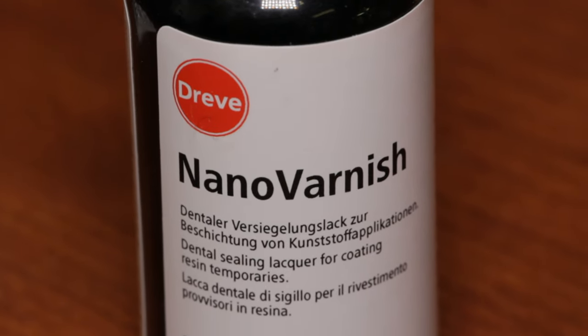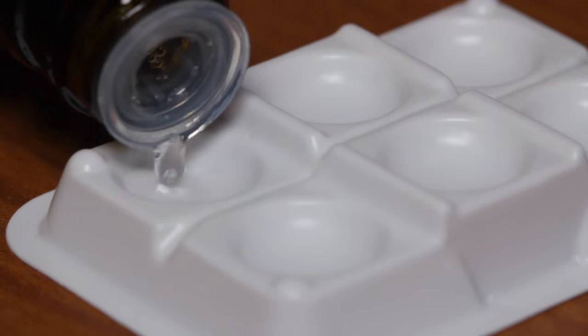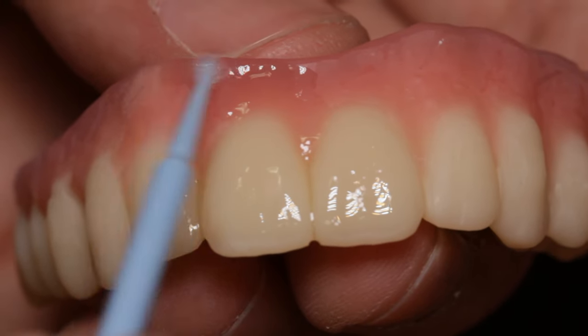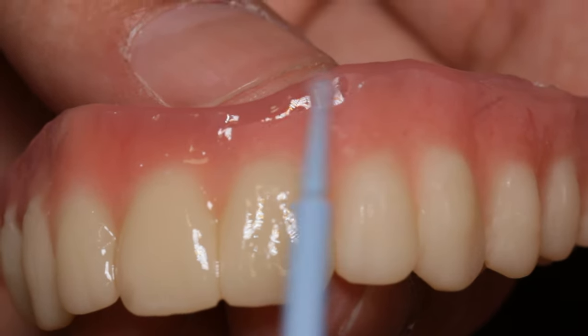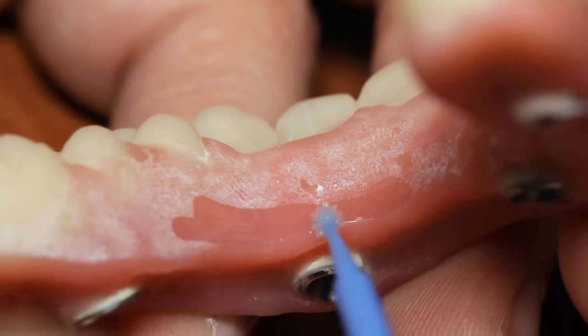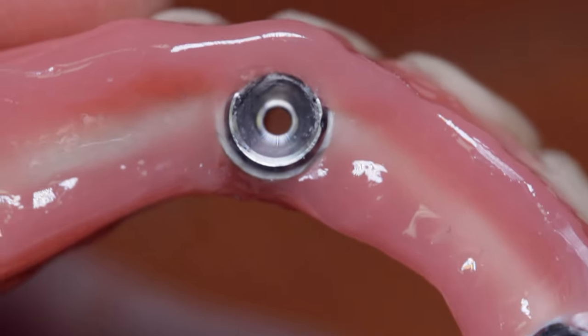To glaze the surface, I recommend NanoVarnish from Dreve, which is known for its ability to be applied very thin and does not yellow over time. I apply a very small amount with a micro brush and make sure that I don't overlap any wet areas I stained before, which can cause bubbles or pits. Be mindful of limiting the material in the occlusal fossa and in between the teeth, as that can also cause bubbles. Cure the glaze for approximately four to five minutes in the UV lightbox.